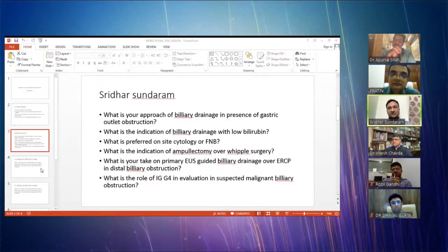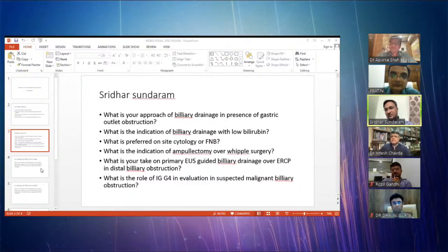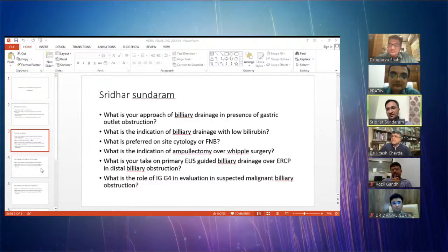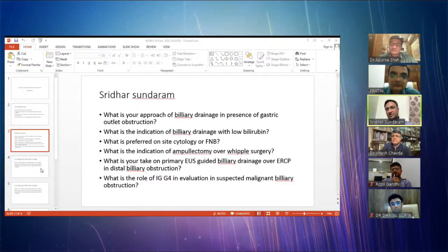And like Sir said, cytology negative ones are the tricky patients. What we've started doing for cytology negative cases is ROSE in addition to taking a routine brush cytology. So I may add a cytologist who can take better samples from our brush cytology.